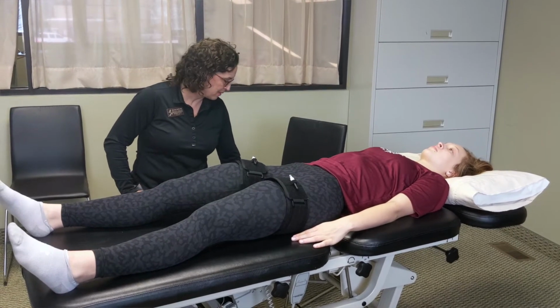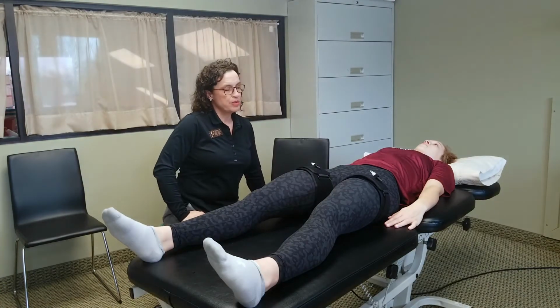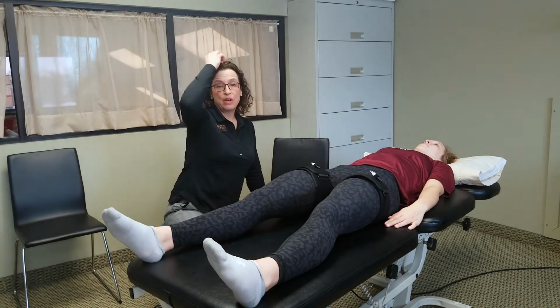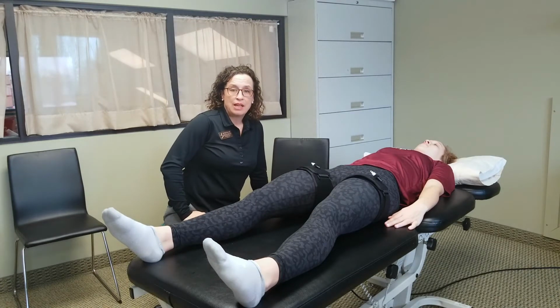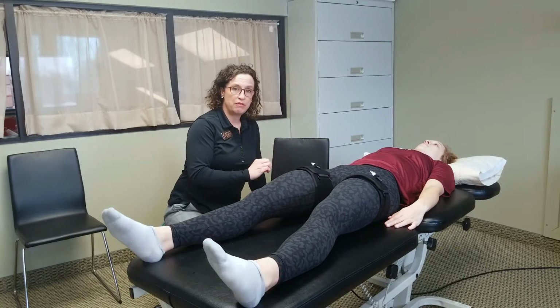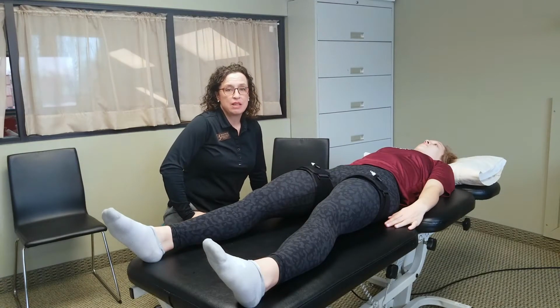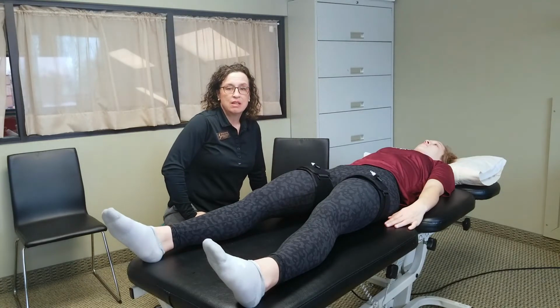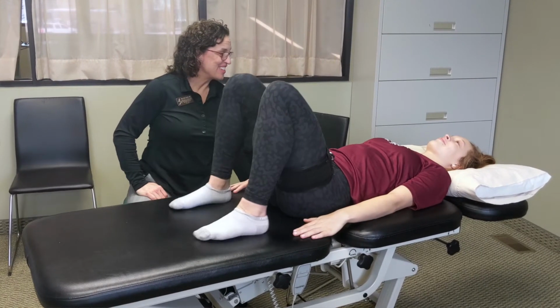So really interesting. The next thing would be that the growth hormone is about 100 times when we do high intensity exercise. And that actually is involved with your pituitary gland in your brain. But with low intensity exercise, you do not get growth hormone. With low intensity exercise, with blood flow restriction therapy, you get a 1.7 time increase in hormone production above the 100 time increase that you get with high intensity exercise. Okay, Rachel, another set of 15. It's going to start getting a little harder.